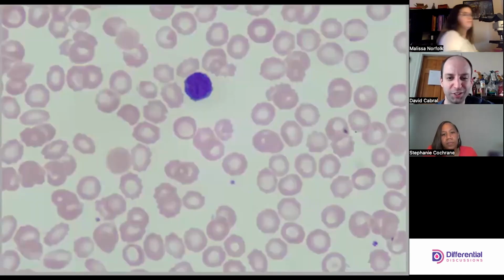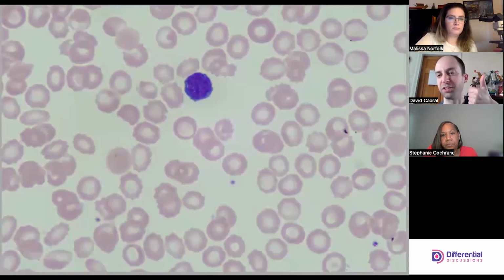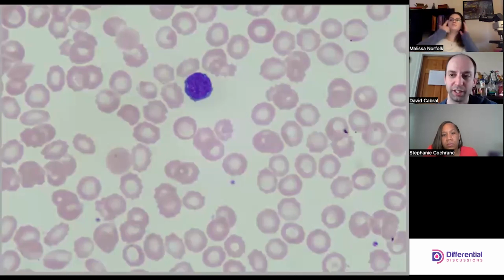Head scratcher. A lot of these lymphs look really basophilic. So it's definitely a reactive process going on here. I think it's hard to look away from the reactive picture now and the aplasia and circumstantially say that's the most likely cause. Yeah, I would have to agree. I'm going to rule out leukemia. I think it's safe to step away from leukemia.